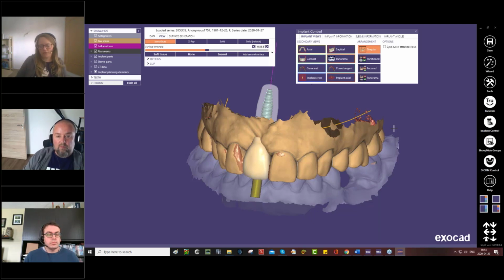It's an open software, of course. But the library structure for exoplan is pretty complex. So I wouldn't do that if I don't know what I'm doing. But in theory, there's nothing stopping you.